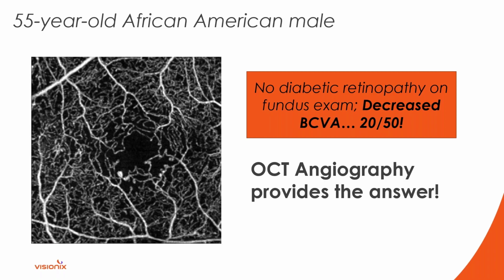And you can see here once again this very anomalous FAZ. You can see a huge microaneurysm. You can see tons of capillary non-perfusion. So this technology has shed more light on a term called macular ischemia. What macular ischemia essentially means is that clinically, we're not seeing anything, but at that vascular level, there is a high level of ischemia going on, resulting in decreased vision.